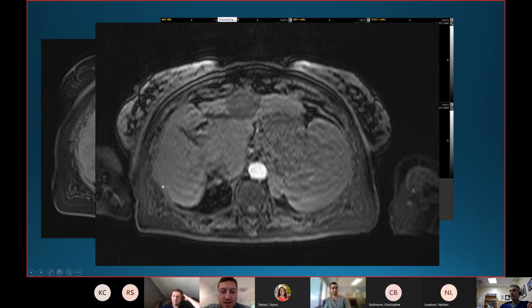Yeah, I've got a quick question. So obviously in like a non-trauma setting, would there ever be a time where you would want to measure, say, the diameter of whatever vasculature you're trying to occlude before you put out like a plug or something like that? Yeah, so even in trauma settings, you still do that because you want to know the caliber of vessel that you're embolizing so you can select your device.